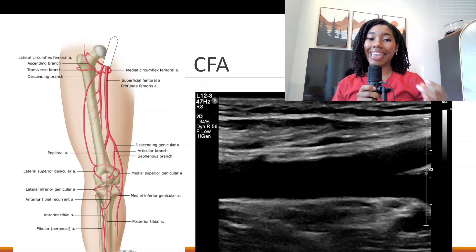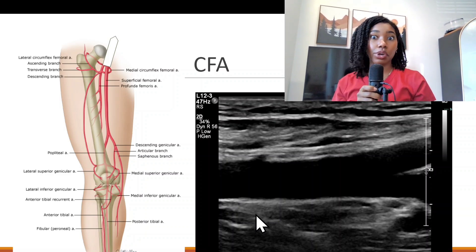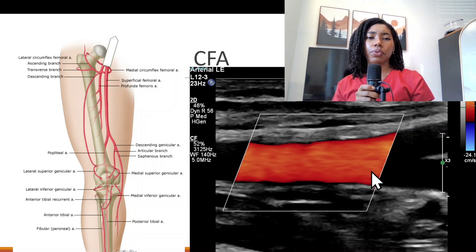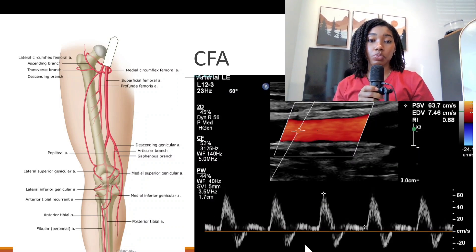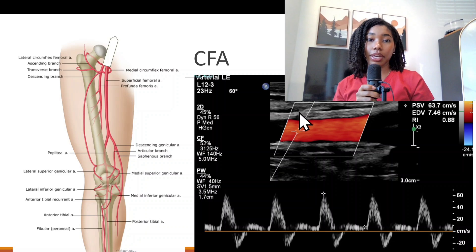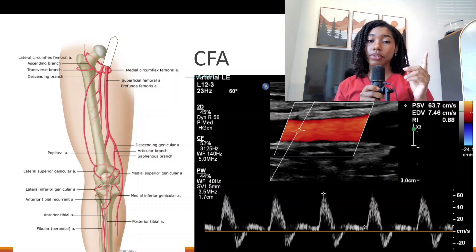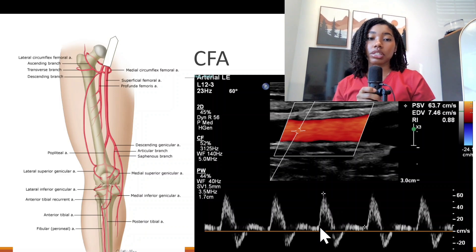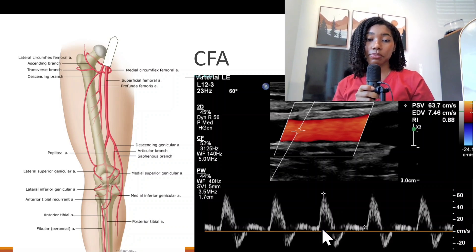We're going to take a 2D image of the common femoral artery in longitudinal. Each facility's protocols are different, so do whatever your protocol says. With the transducer in the same position, take a color image of the common femoral artery. Some places combine these and do the color with the pulse wave together. Make sure the sample gate is in the center of the vessel — both between the anterior and posterior walls and from lateral to medial. You'll see a clear spectral window, meaning no echoes in the center, confirming you're in the correct position.